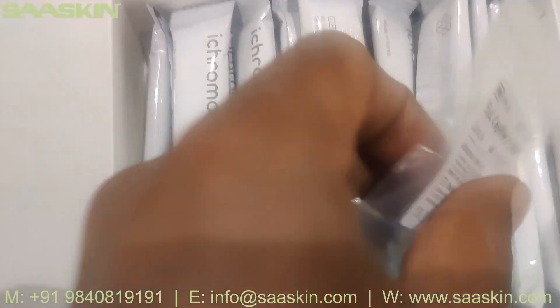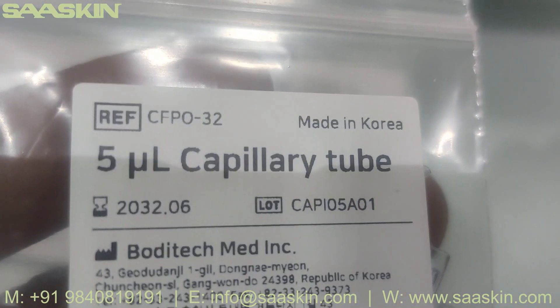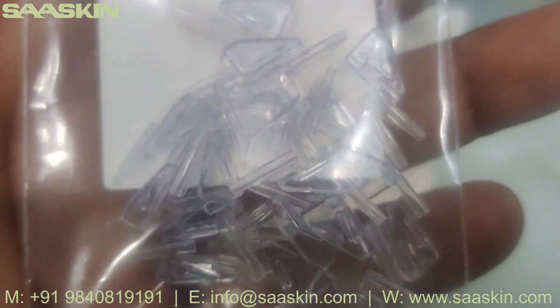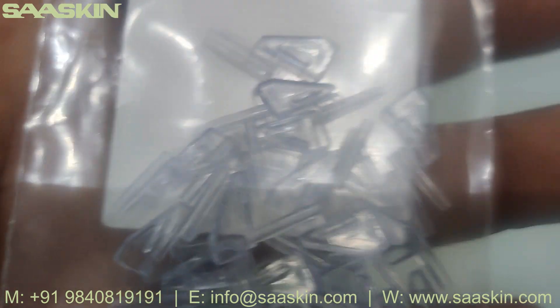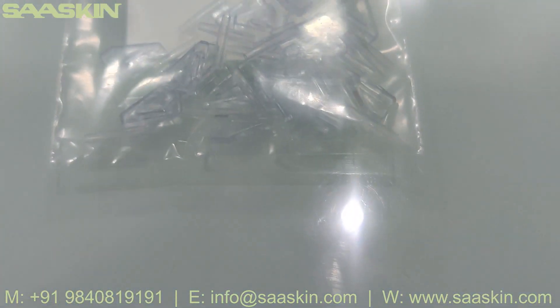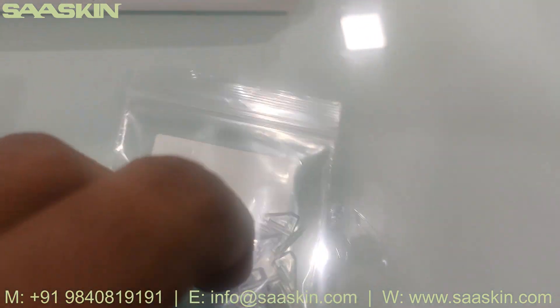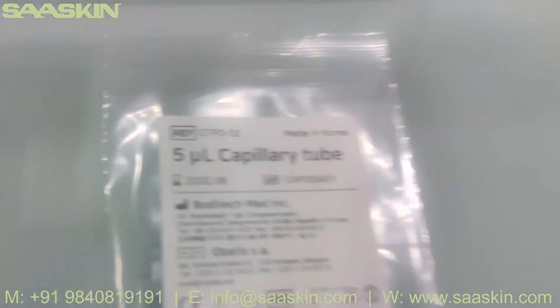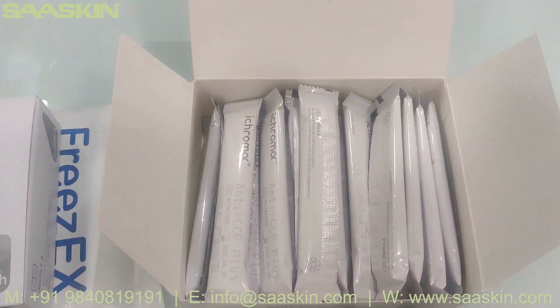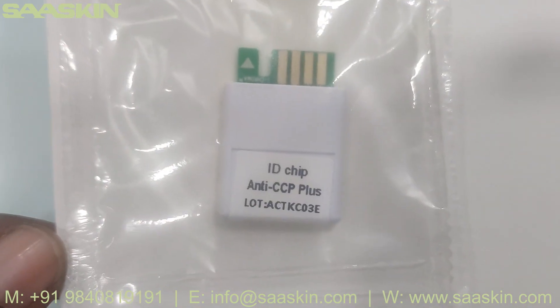Inside you also have a five-microliter capillary tube. Since it is a 25-test kit pack, you have 25 pieces of the capillary tube. Then you have the ID chip — the ID chip is placed here, labelled 'CCP Plus'.